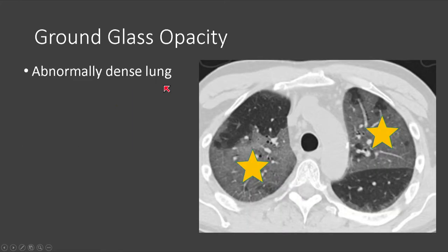Ground glass opacity represents abnormally dense areas of lung that do not obscure underlying bronchovascular structures, and we can see that on the CT on the right. There are areas of abnormally dense lung that do not obscure or distort underlying airways or vessels. This is what we would call ground glass opacity.